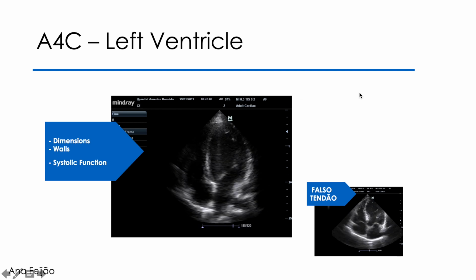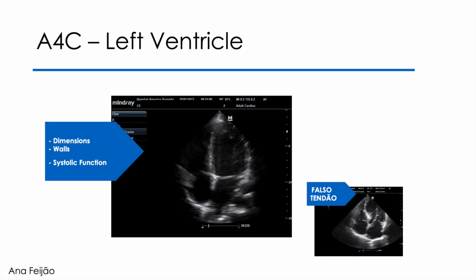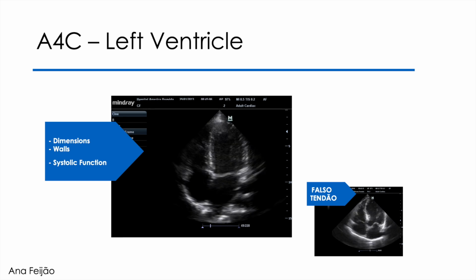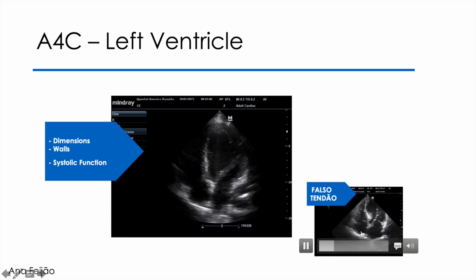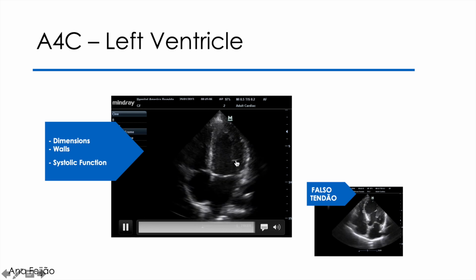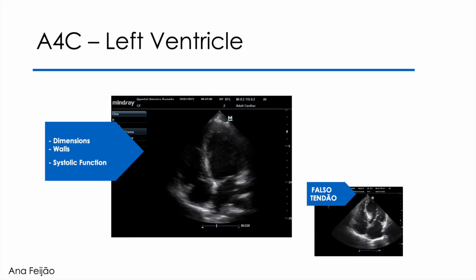I evaluate the walls and the myocardium, the echogenicity, if there are variations that have nothing to do with the technical commands, if the myocardium is granular, the thickness of the walls, the symmetry of the thickness of the walls. I evaluate inside the cavity if there are trabeculae, if there are false tendons, masses, if the papillary muscle is well inserted and well visualized, or if there is any thrombus.